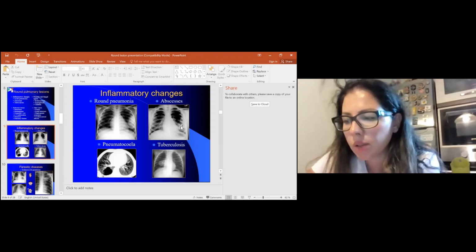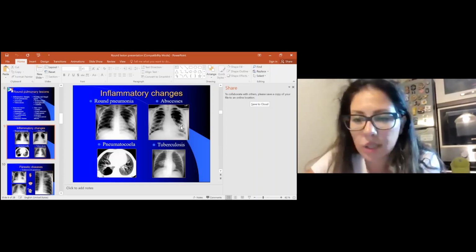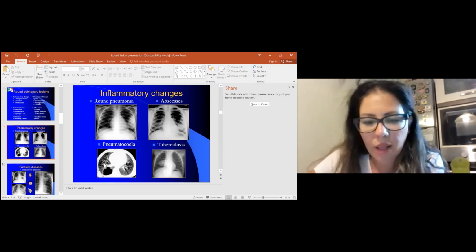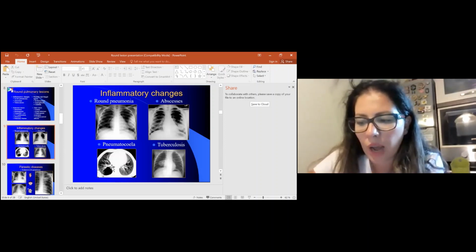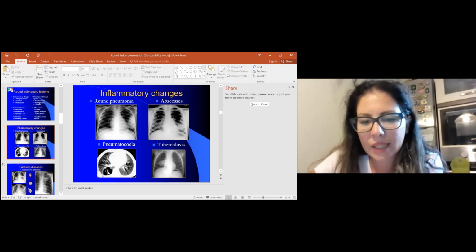Differential diagnosis may be bronchiectasis, complicated cyst, tuberculous cavern. Pneumatocele is formed often after gram-negative bacteria such as Escherichia coli, and it can be visible up to 6 months.